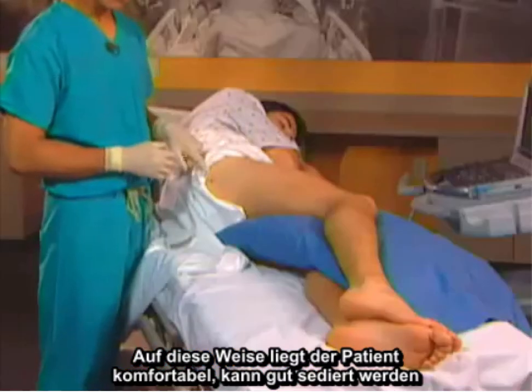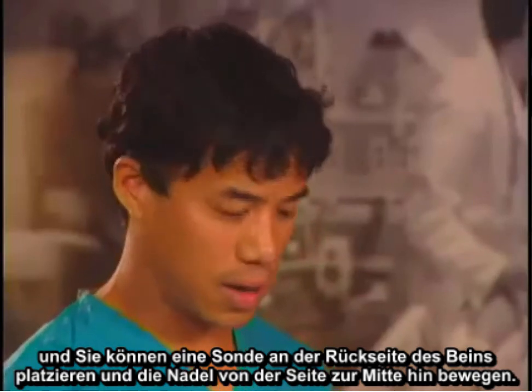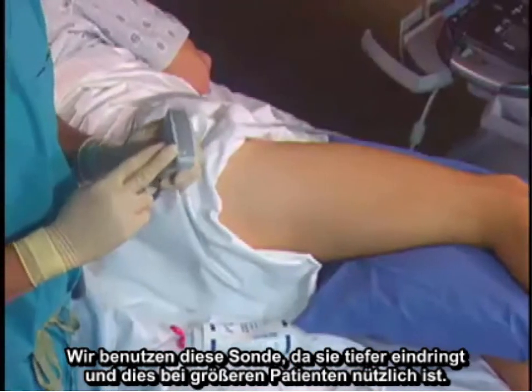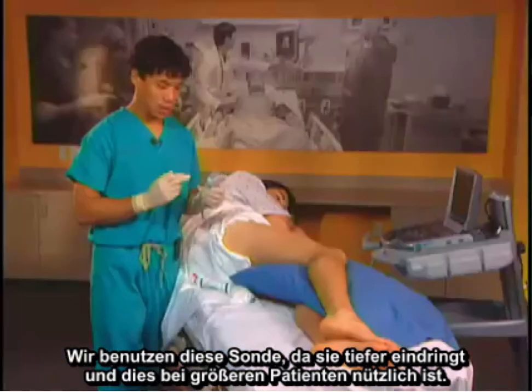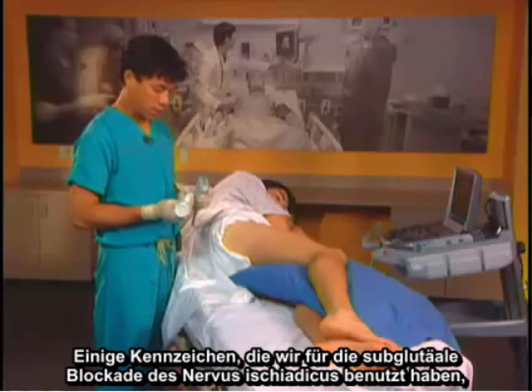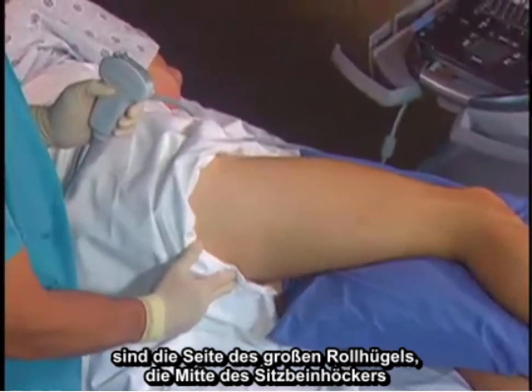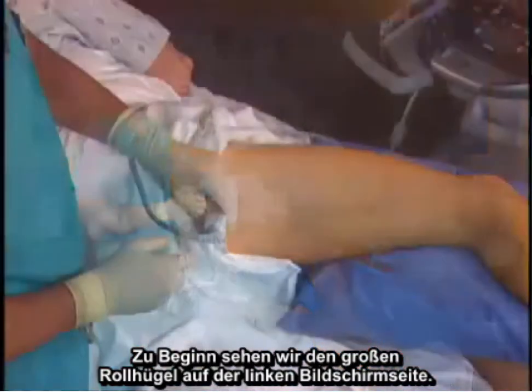With the patient lateral, they can be well sedated and you can place the probe on the posterior side of the leg and advance the needle from lateral to medial. The probe we use for a sciatic nerve block is a curvilinear low frequency probe, because it penetrates deeper, which is useful in larger patients. The landmarks for the subgluteal sciatic nerve block are the greater trochanter laterally and the ischial tuberosity medially.